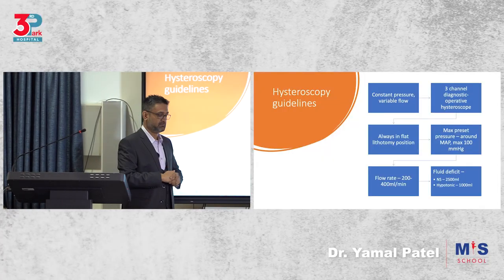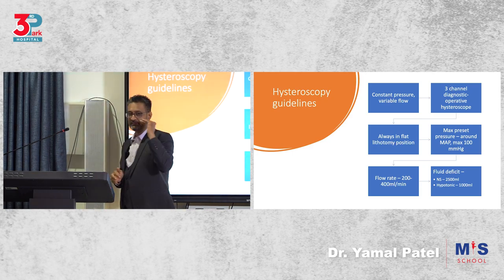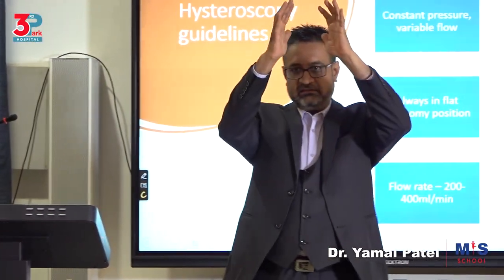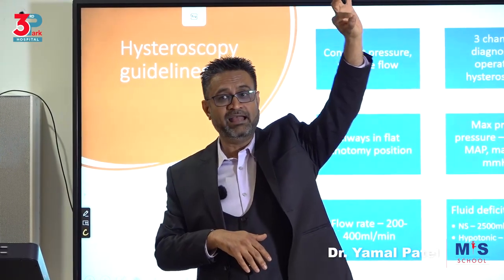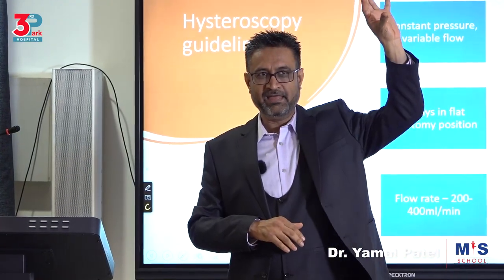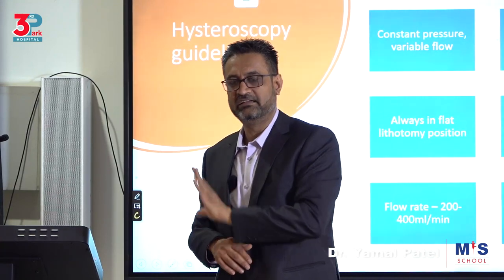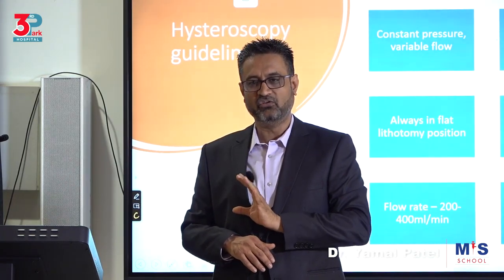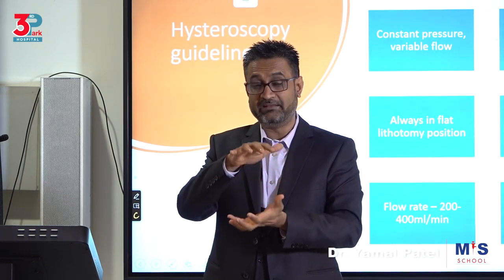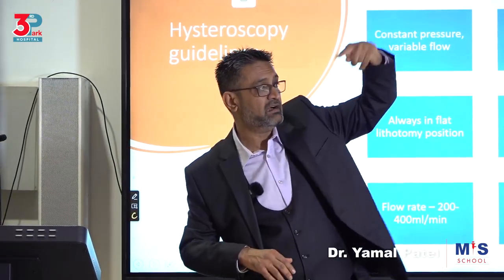The basic guidelines on hysteroscopy. Number one, remember you're going to be working with a constant pressure, variable flow system. So what does that mean? When you use saline in a bag and have gravity, it can work for diagnostic procedures, people do it. But remember, that is constant flow and constant pressure. You've understood? So it means you're not going to be able to get a distension the same way you want at all times.